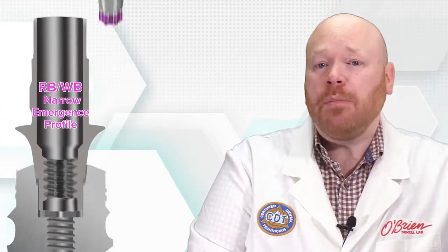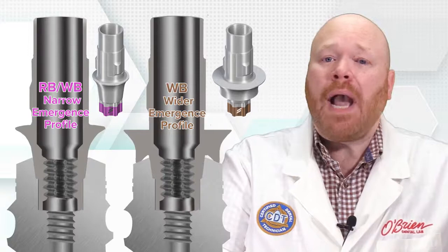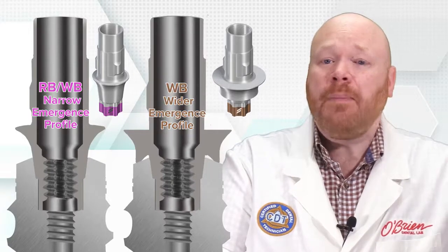The components that will work on all of these implants are called RBWB, and they feature a narrow emergence profile at the connection. The components that will only work on the large diameter implants are called WB, and they have a wider emergence that actually rests on top of the implant.